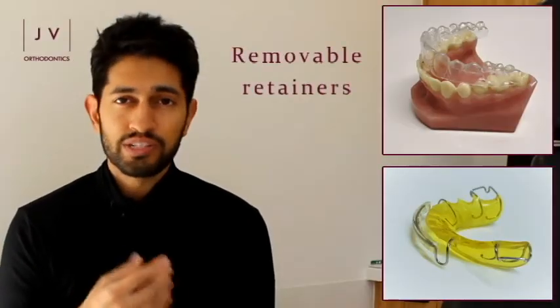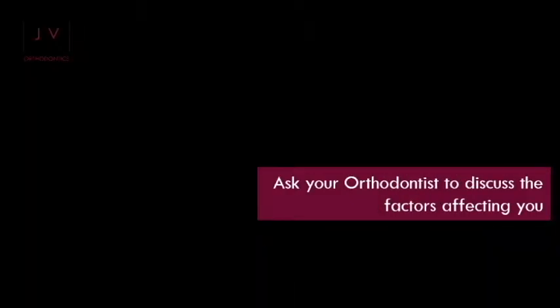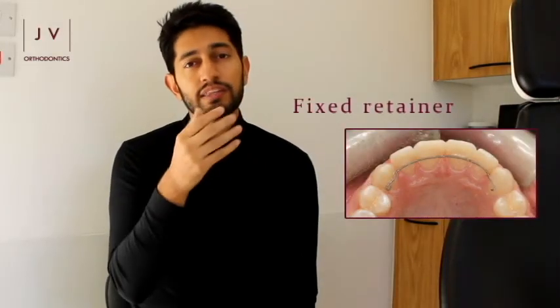A removable retainer is a retainer that you can take out and put back in as you wish, and they both have their uses, benefits and disadvantages. Usually we tend to only hold the teeth that are absolutely necessary with a fixed retainer.